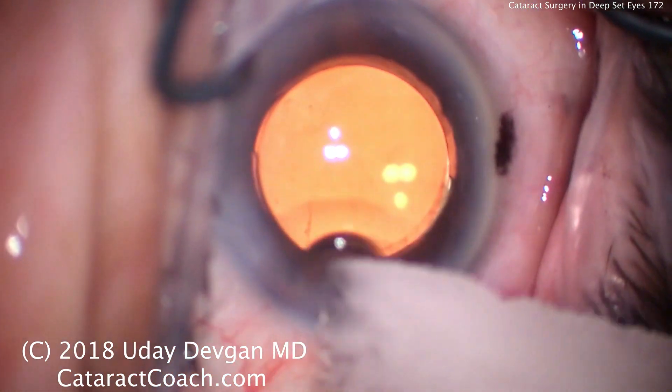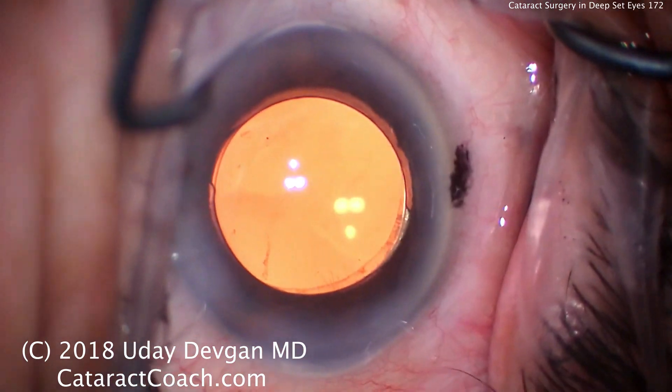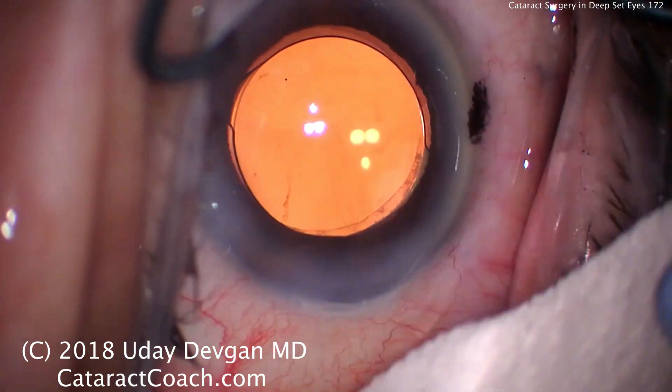Deep-set eyes have a lot of challenges. Some people may even advise doing a retrobulbar injection, because the retrobulbar injection will add some orbital volume and hopefully proptose the eye a little bit.